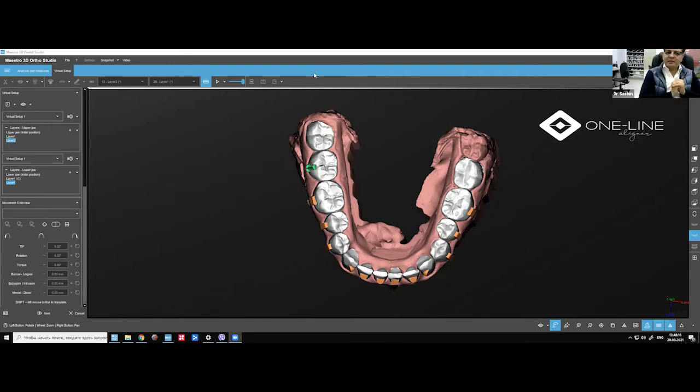I think this question normally appears because the sheet is not flexible. For flexible sheets, this question should not be there. This is only for the sheets which are one layer, single layer. This is what I believe, because I've tried all kinds of sheets. I've tried around 7 or 8 different companies. So I've seen it maybe only for single layer. For multiple layers, I don't think this is a problem actually.